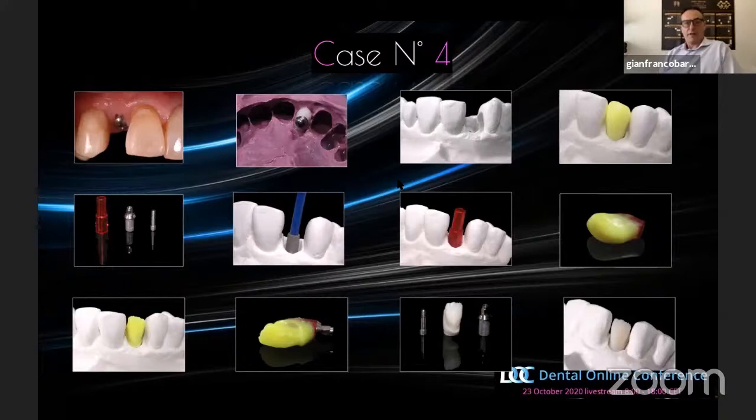We have this abutment, in which two heights can be chosen. We can see the line that represents the minimum height that we can have. We can cut there, not deeper than this.